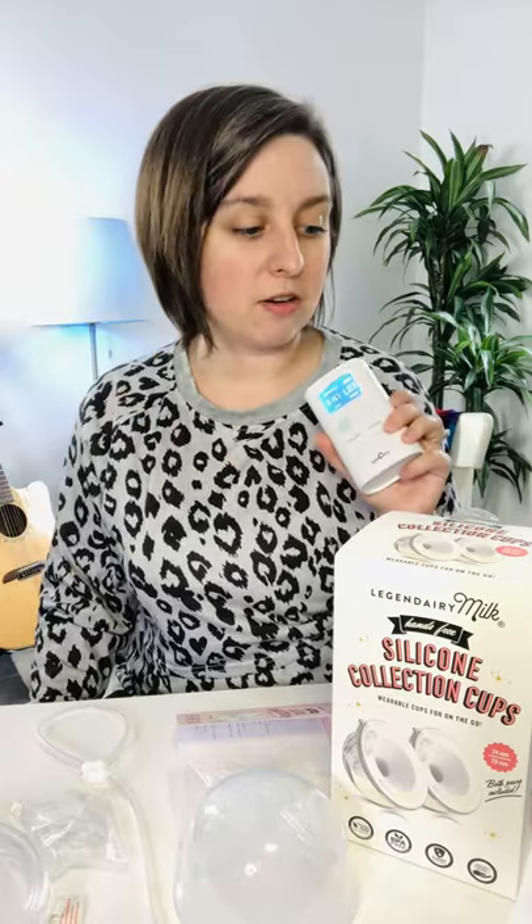Right after this I'm going to film a YouTube video comparing the Legendary Milk cups with the Carat cups and the Freemie, because there's some differences between the three and I know you'll want to know that. Sorry for the pumping sound going on in the background — the Spectra 9 is a fine little pump but it is a little loud.